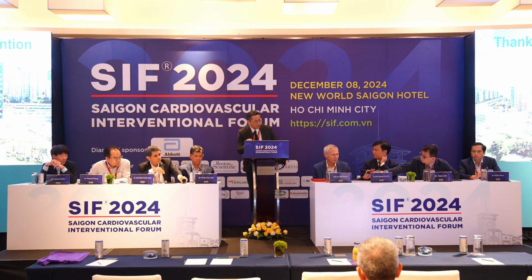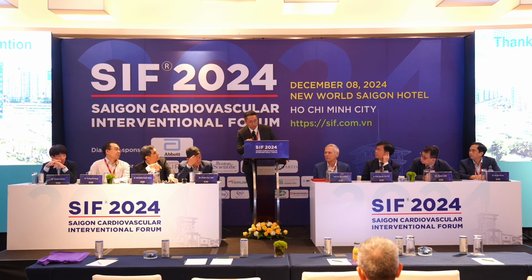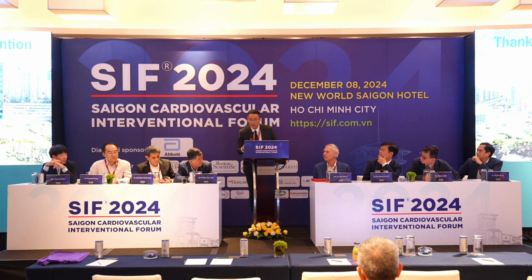Because this case is one of my first cases of stent ablation, I just wanted to make sure it guarantees the safety. That's why I tried to perform the stent ablation with the 1.25 burr, because the particles are smaller than when I use a 1.75 burr. So I really wanted to step up from the 1.25 to the 1.75 to make sure of patient safety.